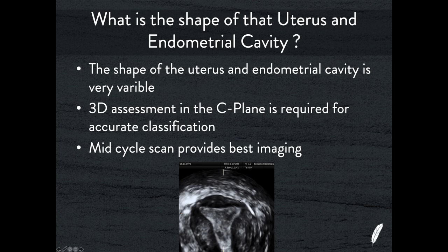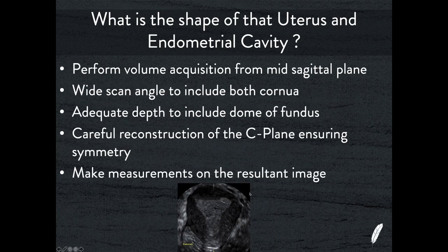Perform a volume acquisition with your transducer: using a transvaginal transducer placed in the sagittal plane, use a wide angle so the machine mechanically sweeps left to right, capturing both cornua and enough depth to include the dome of the fundus. Once the machine is set up nicely for that, get a nice volume and reconstruct it in the C-plane, tilting and adjusting it slightly to ensure it's beautifully symmetrical. This is a really nice example — I've got the fundal dome on here, nice symmetry out to both cornua, and I can appreciate the shape of the myometrium and the endometrial cavity.